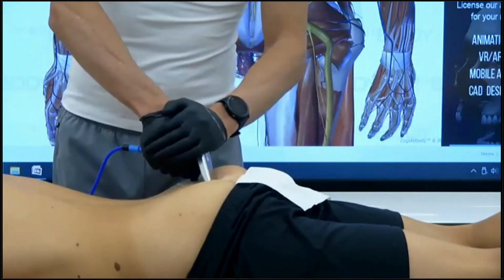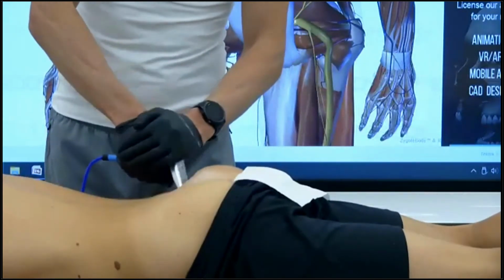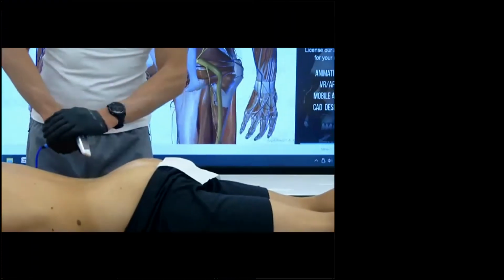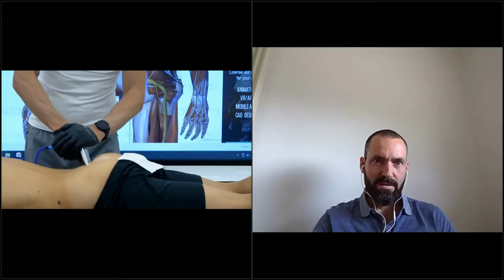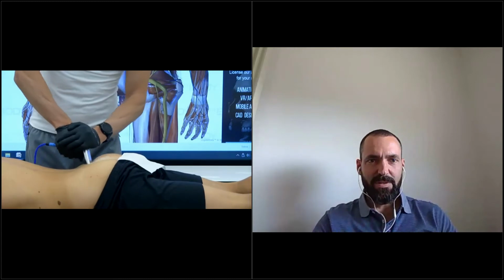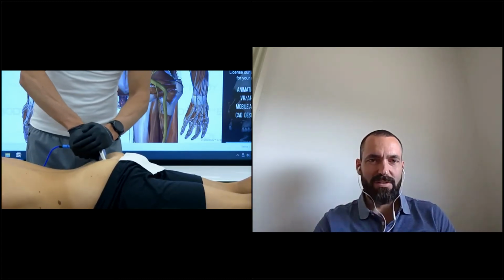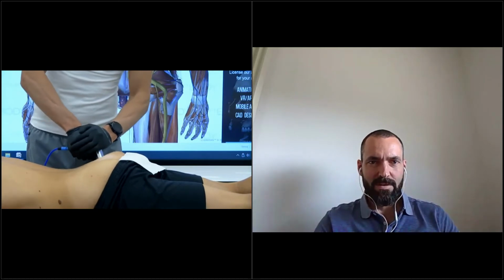Do you use the same plate positioning? Are you using the same way of treating the muscle in this case, or what you're going to do in your day-by-day practice? Yes, especially for piriformis this is a good way, in my opinion, but I like the lateral bend.